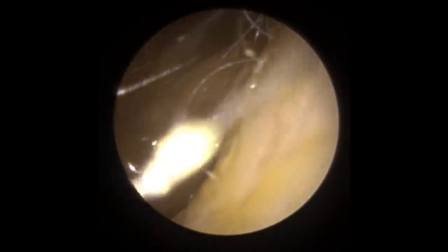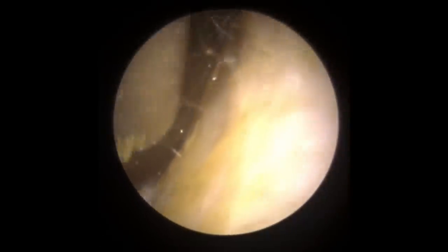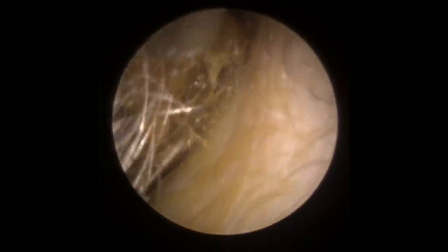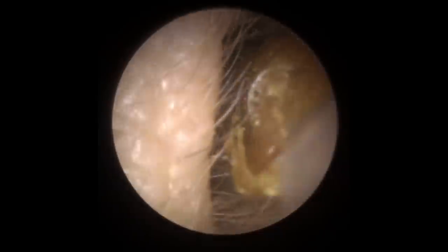You can see this is the other ear canal now. We've got a lot of dry skin in here - it's got that sheen to it. I think this is that stretchy, toffee type wax we talk about sometimes, which stretches out of the canal. So I'm going to use the larger tube now. The patient's a little bit more settled after having the one ear cleared. We're just going to go in with the larger Zolna tube on this one. You can see we're just trying to get a grip on this wax, and see it's starting to stretch - you can see a ribbon of it. It's starting to come out of the ear canal.